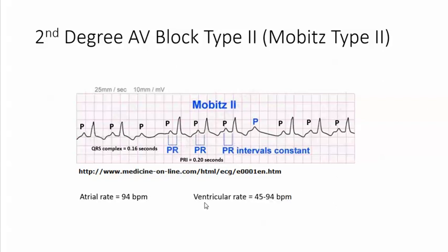The last thing we want to look at is the ventricular rate, and it's 45 to 94 beats per minute, so the ventricular rate is irregular. You have more P waves than R waves or QRS complexes. The PRI is constant and the QRS complex can either be wide or narrow — if the block occurs at the bundle of His, it's going to be a narrow QRS. All those features make up Second Degree AV Block Type 2.